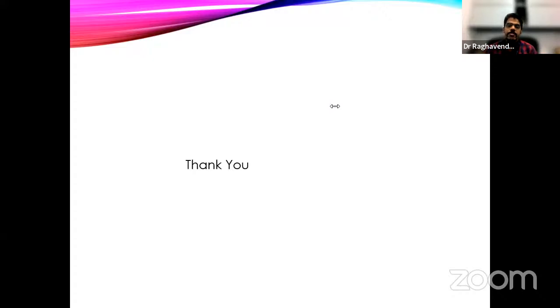The reason here is the PET resolution is not less than 1 centimeter, 5 mm to 1 centimeter. Especially when you go to extracranial, one PET acquisition position, even in the digital machine, goes about 5 to 8 minutes. So you are acquiring information over a period of 5 to 8 minutes, minimum of that. And in that 5 to 8 minutes, that many breathing cycles are done, the patient would have moved.